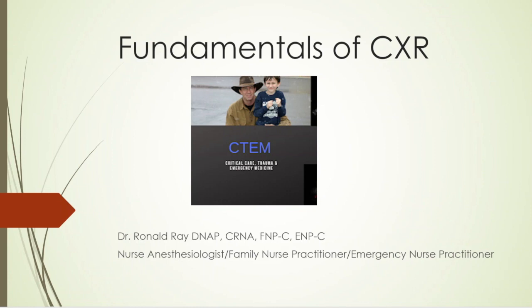We're not going to get into all the esoteric stuff that radiologists do because they're there for a reason, but you should be able to pick up the basic things. Line placement, pneumothorax, CHF, pneumonias, at least simple pneumonias. Some can be more complicated. But we're going to go over a method of reading that should allow you to do this. So, hope you enjoy it.